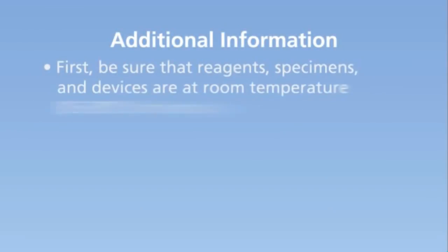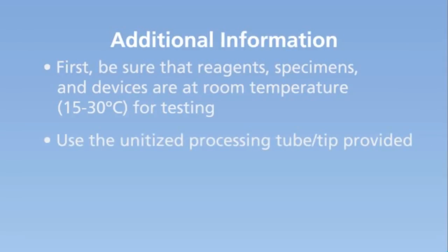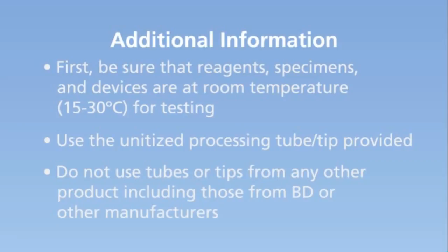Here are some things to remember before conducting a test. First, ensure that reagents, specimens, and test devices are at room temperature for testing. Use the unitized processing tube and tip provided. Do not use tubes or tips from any other product, including those from BD or other manufacturers.